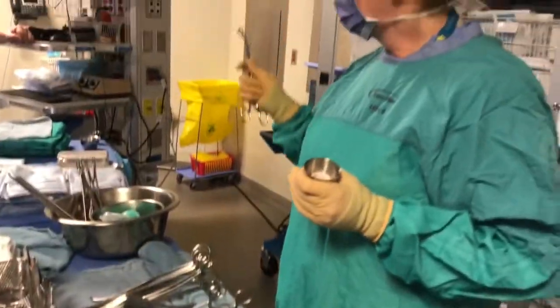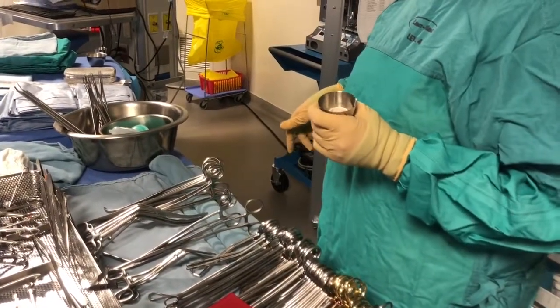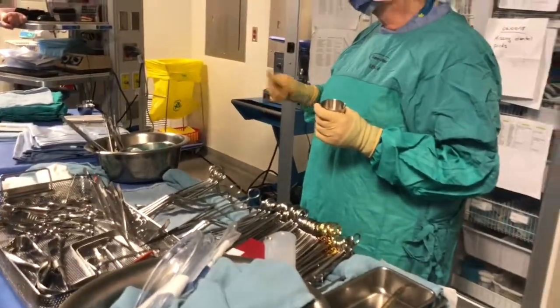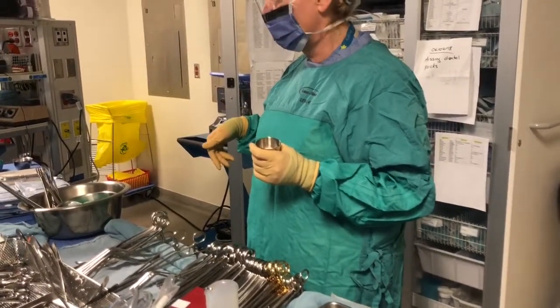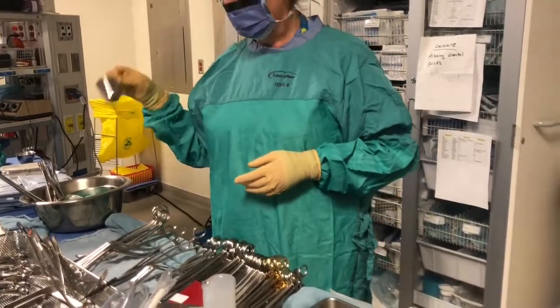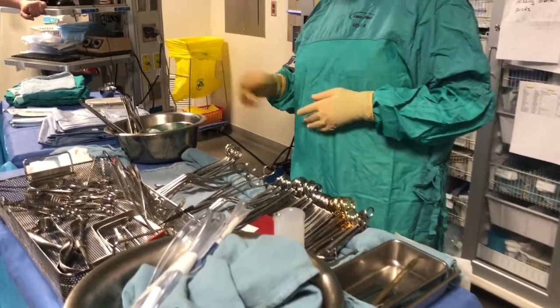That's for the varicose vein? No, that's for somebody that's lost some circulation in their leg. If the vein is gone, they could salvage a vein out of the arm and put it in the leg to pink up the foot so that they don't lose their foot, basically. So this is what the methylene blue is for. Not in an aorta though.